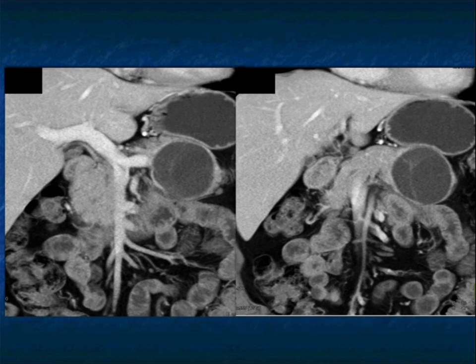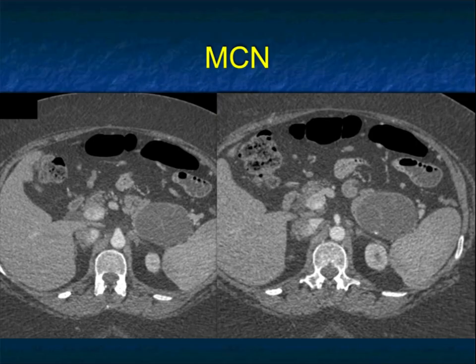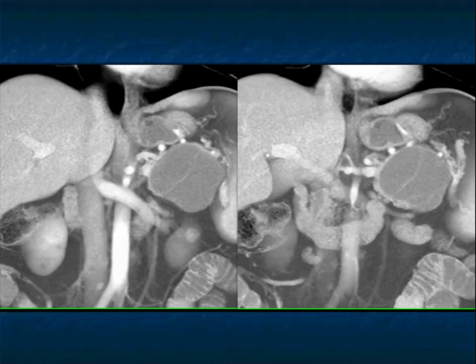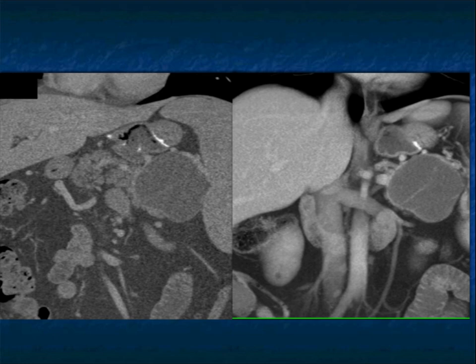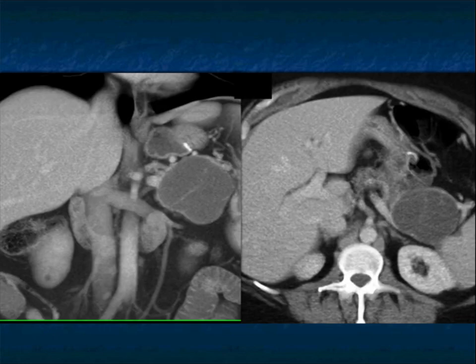We often speak about neuroendocrine tumors with rim enhancement. These MCNs can often have rim enhancement as well, though probably not to the same extent. Another example: lesion by the tail of the pancreas — great location — faint calcification, septations. Septations very nicely shown on the volume rendering. A very nice example of a classic case, female with an MCN.